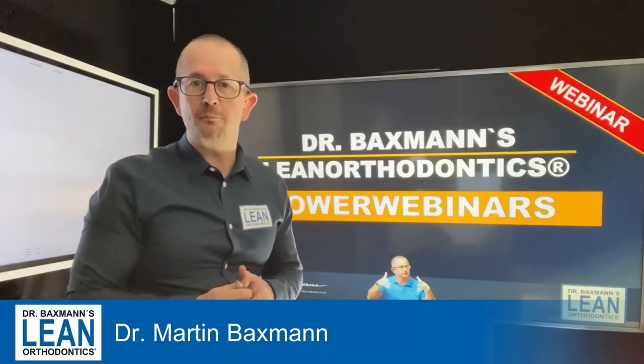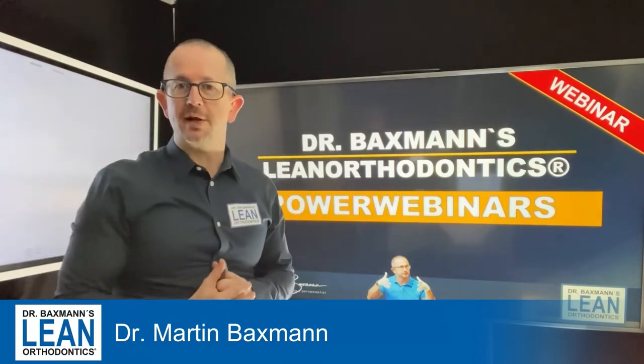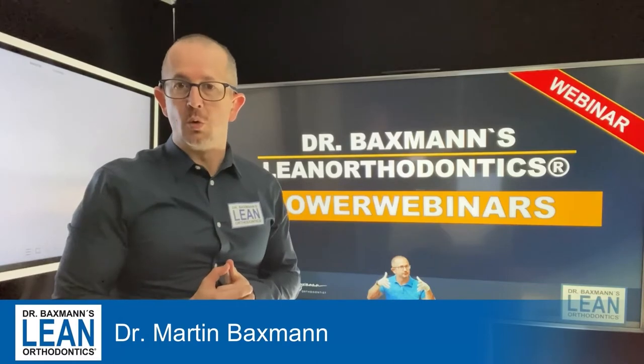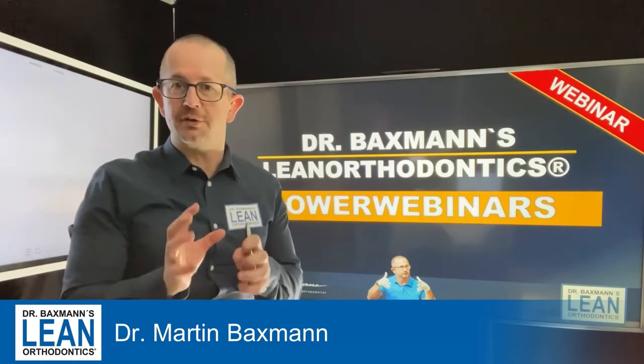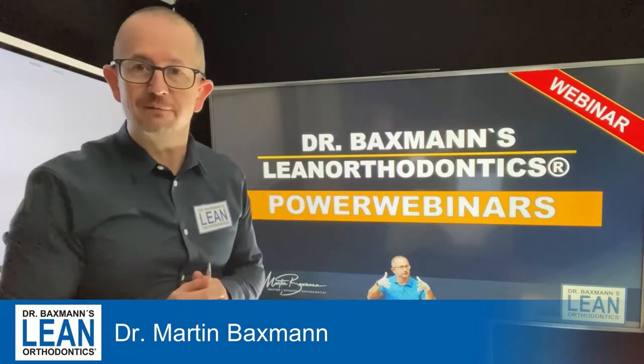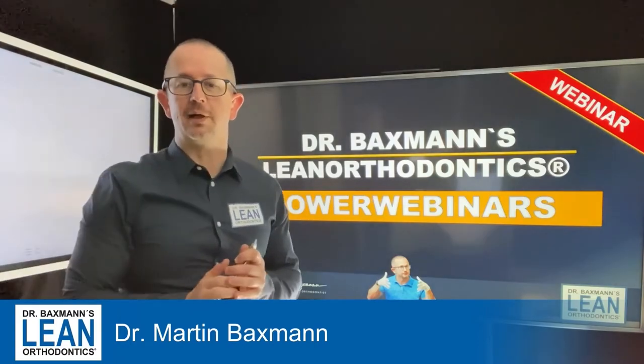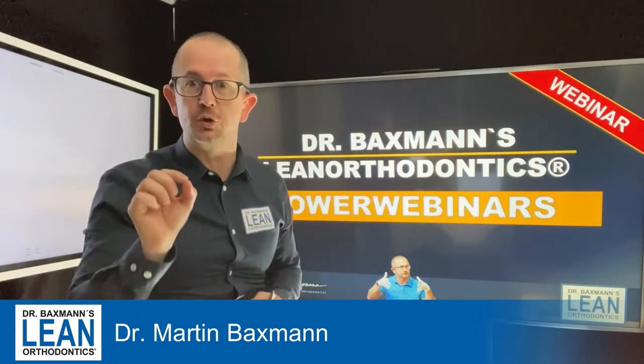Welcome to another episode of my power webinars in lean orthodontics. My name is Dr. Martin Baxmann. Today we are going to do some cantilever wire bending, and what you need is a 17-25 stainless steel wire and a loop bending plier — now let's get down to action.